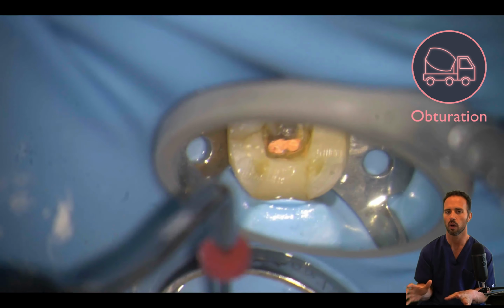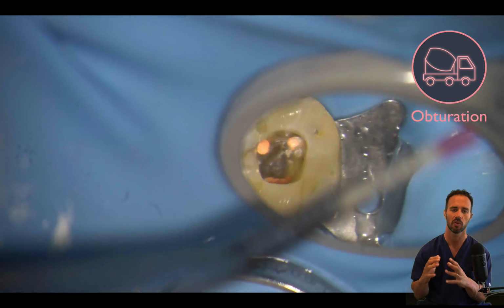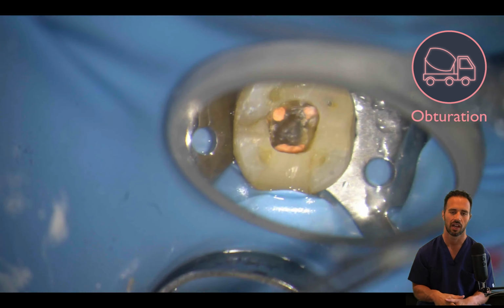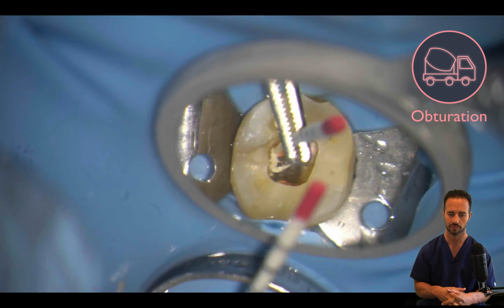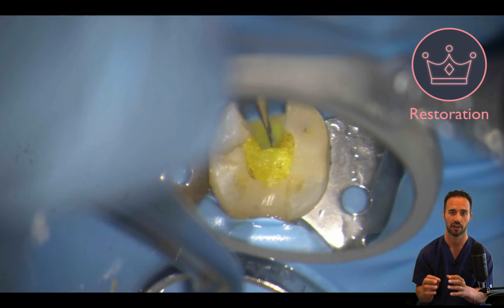Again, I'm not one to overly edit my case demonstrations because I want you to be fully aware as to what to expect in terms of how long to schedule your appointments, and also so I'm being realistic with you and you know what to expect. And sometimes I use the paper point just to remove any excess sealer there. So again, I'm somewhat of a perfectionist with this.